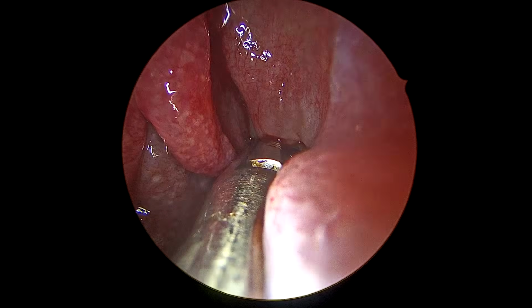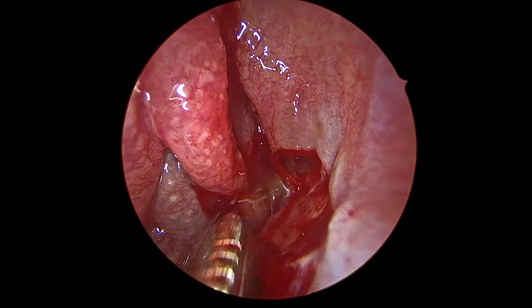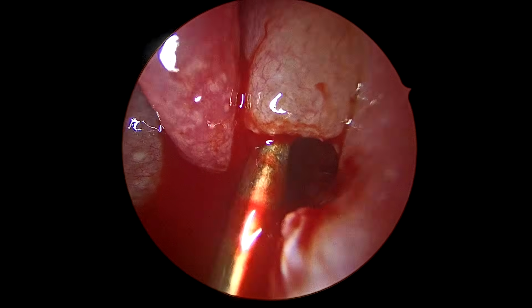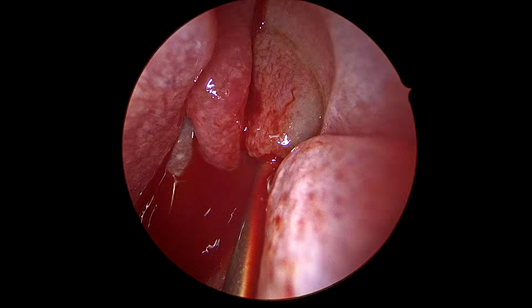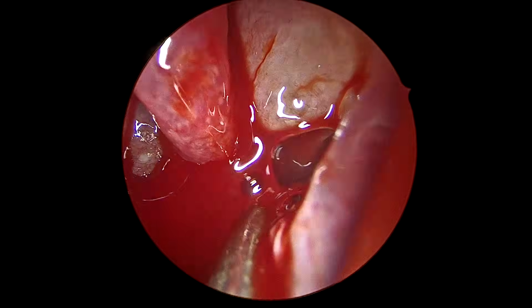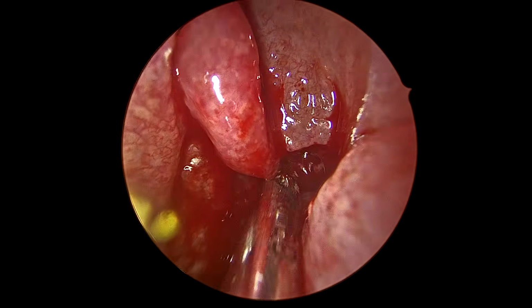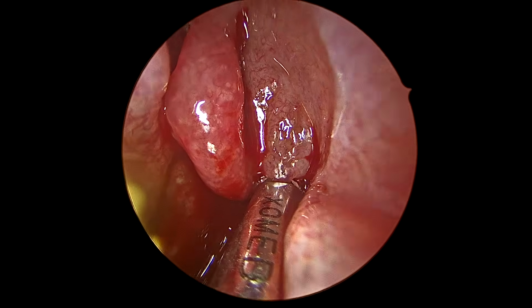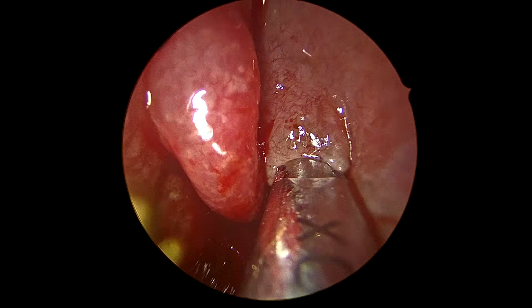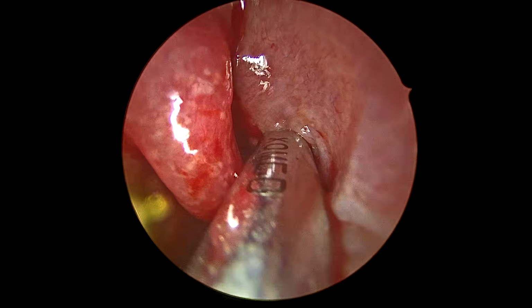What you can see right now, I am using the backbiting forceps to do the uncinectomy on the left side. So, uncinectomy has been done. You can see some amount of bleeding also. Now I am outfracturing the vertical part of the uncinate so that I can take it out safely. You can also see some bubbles, which shows that we are at the verge of entering the left maxillary sinus. So you can see this is removal of the vertical part of the uncinate process.